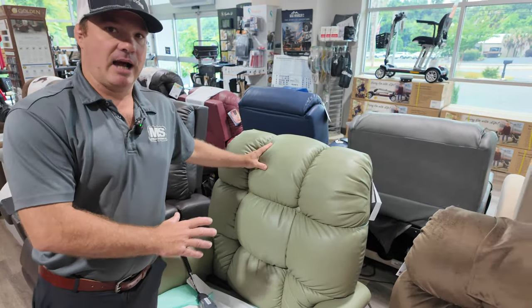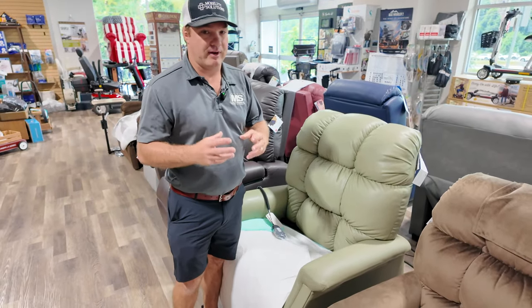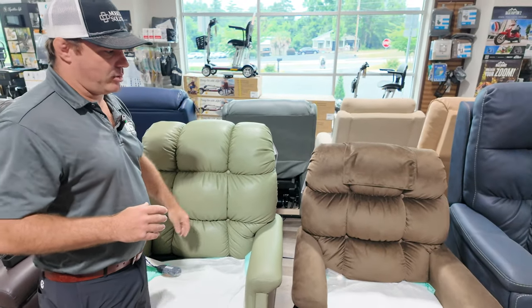Not the best for someone that's highly incontinent like a vinyl would be. I'm not a big vinyl guy because vinyl cracks and stuff, but this won't change colors. And you're going to see this fabric on some other chairs I'm about to point out.